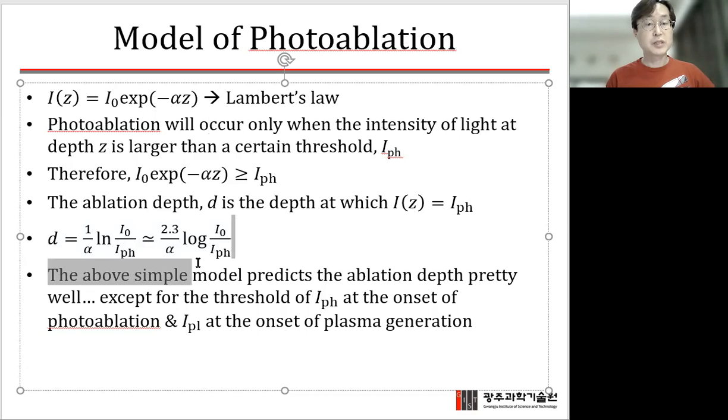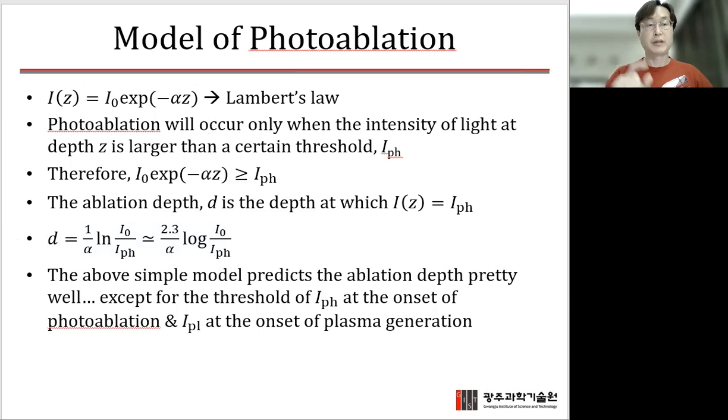By using this, you can easily estimate the depth when you are using the laser for ablation. But this works between the threshold of the photoablation and the threshold for the plasma generation. Between those, it works well. However, below or higher than the plasma generation threshold, this simple model doesn't work well.